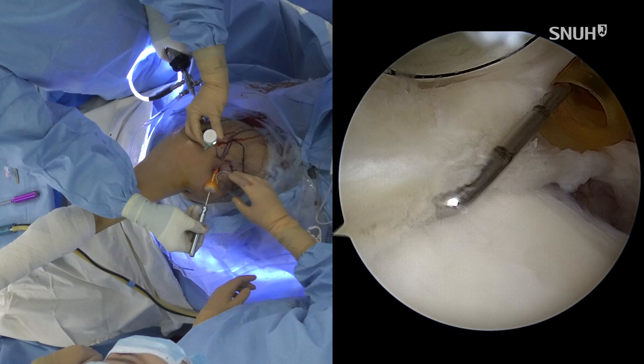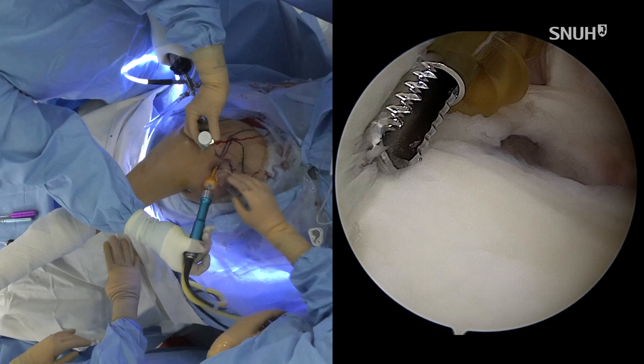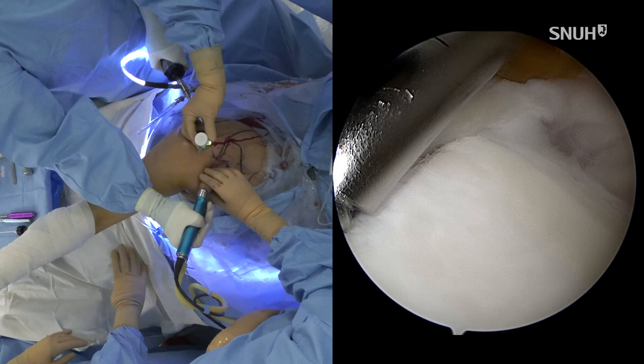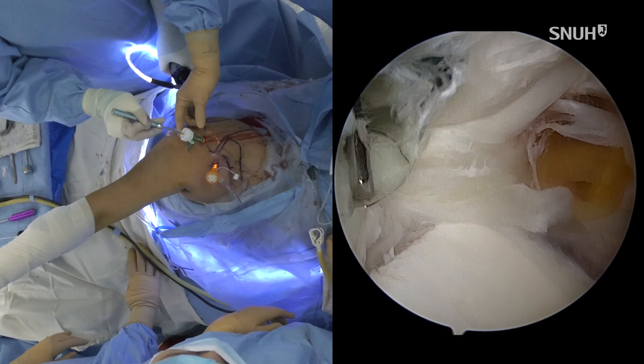So I would like to check the decortication over there. Some more decortication. Stop. Probe. I think the subchondral exposure is enough, okay?